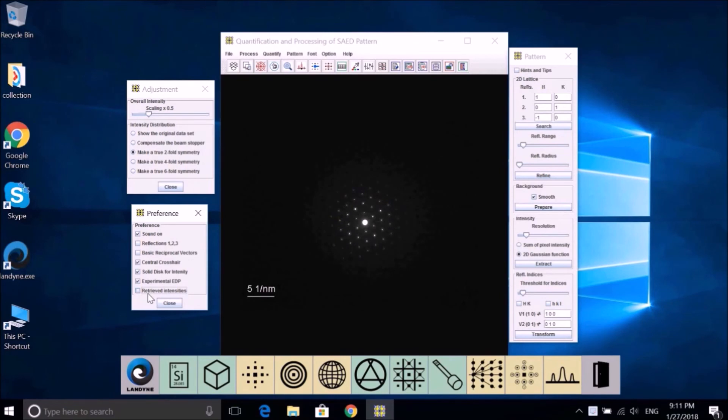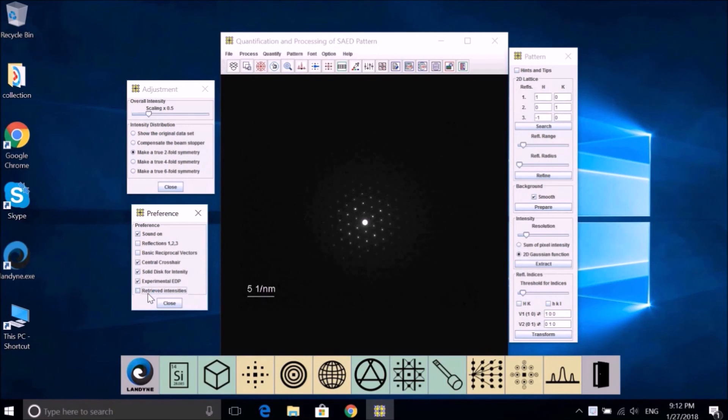The third application is line profile for both periodic or non-periodic lattice. This is for quick measured reciprocal spacing, which can be used in another software for unit cell determination.